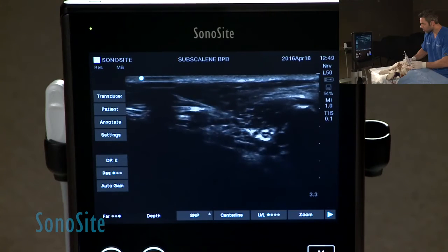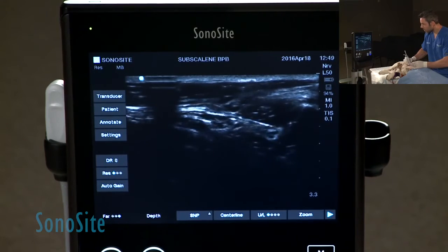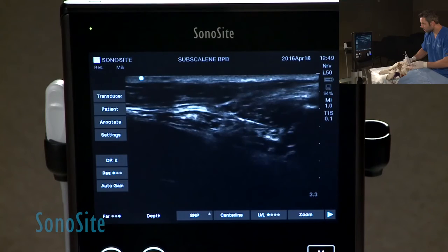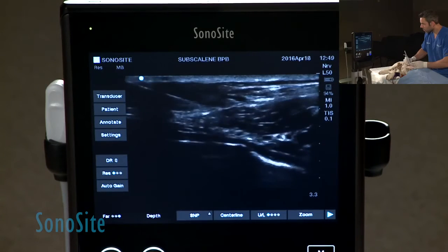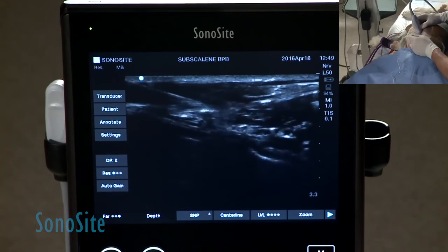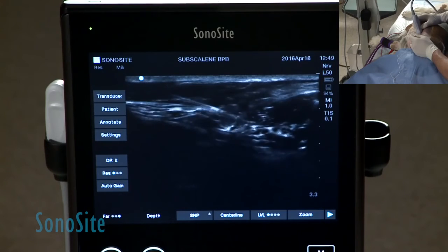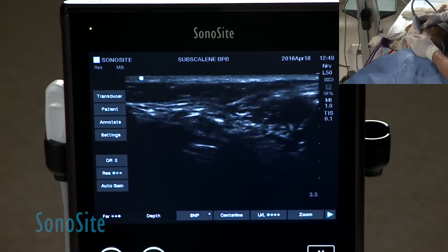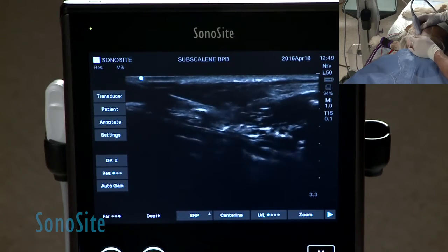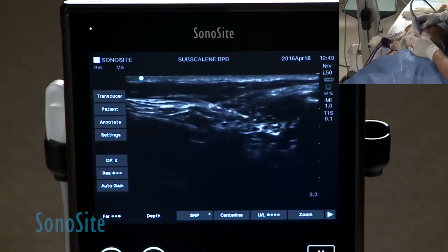I will be trying to coat most of those nerve roots. This is a great technique and a good alternative to the axillary approach because you have less branching of these roots. Dr. Pablo Otero described this technique. I find it much easier for ensuring a complete block. However, it's a much more skill-dependent block and can be quite tricky due to proximity to major vessels and the trachea.